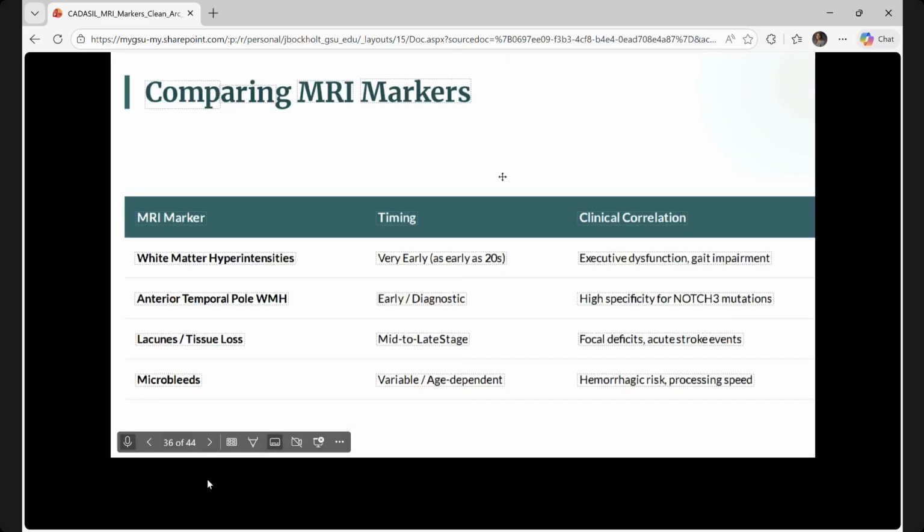One thing that I probably didn't stress as much, but I should have, is that across those various white matter biomarkers that we've discussed, when we first see them, the rate that they change, and when they stop changing is all variable, but also has somewhat of a pattern.